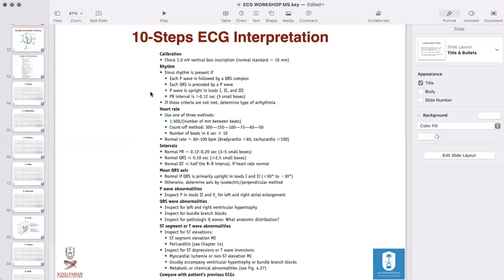The next step, later on, once you really have this habit, then you're gonna deep dive and go over, for example, the axis. I can give you a session about it, how to really calculate it. It's very simple. It's time consuming, but it's simple. And the computer does a good job most of the time. I hope I answered your question. Thank you.